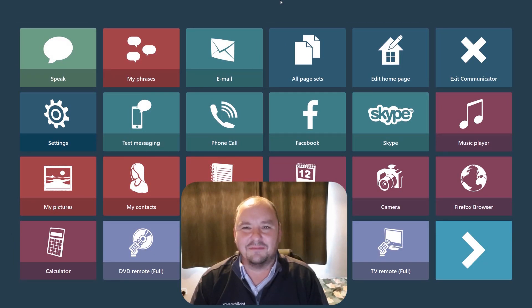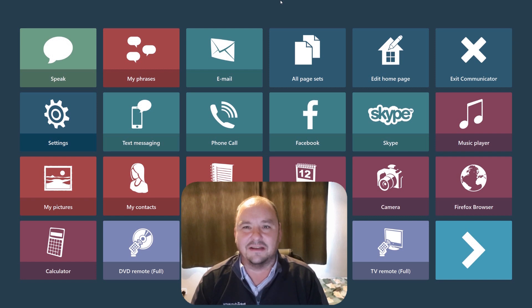Hi there, my name's John from Tobii Dynavox and I'm here to show you in this video the impressive email functionality of Communicator 5.